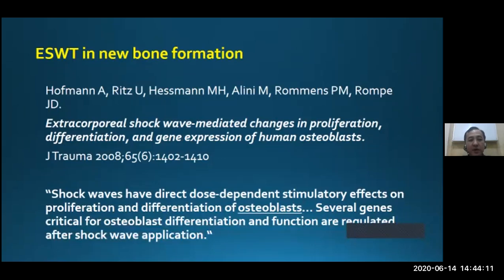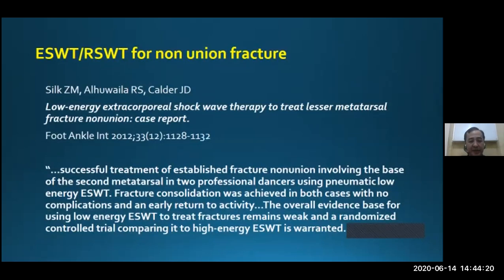So shockwave also would have an effect on new bone formation. And how about for union, non-union fracture? There's a study here that used low energy shockwave to treat lesser metatarsal fracture non-union, a case report. The successful treatment of established fracture non-union involving the base of the second metatarsal in two professional dancers using pneumatic low energy shockwave. Fracture consolidation was achieved in both cases with no complication and an early return to activity.